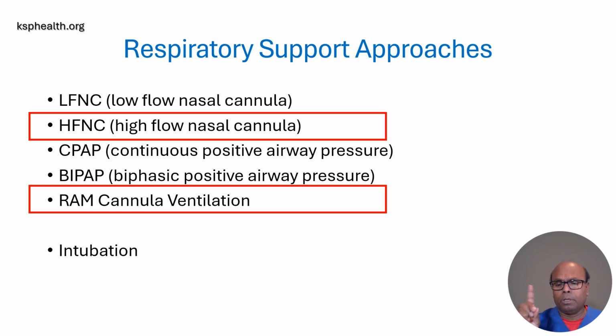The reason we chose this: number one, it is non-invasive. Number two, easy to do. Number three, since there is lots of death happening around the globe, this is more easily doable in resource limited areas. Thus, you can do better care for the patient and prevent mortality. Even in the United States, over the past 10 years, the usage of high flow nasal cannula and RAM cannula ventilation has gone up significantly when compared to BiPAP and also invasive ventilation.